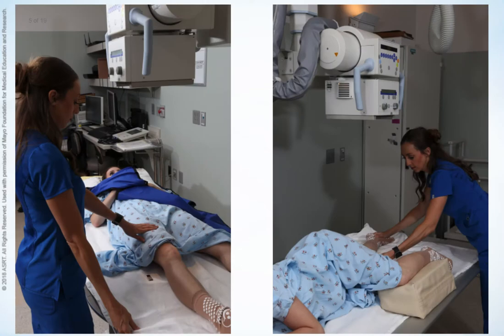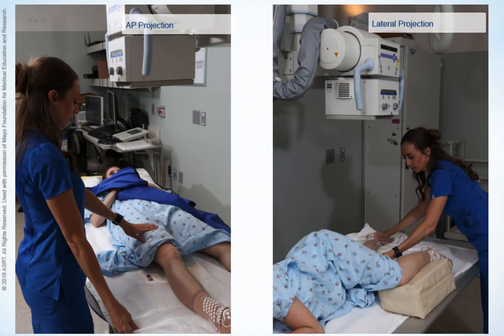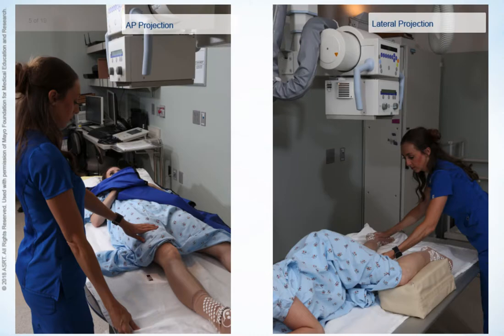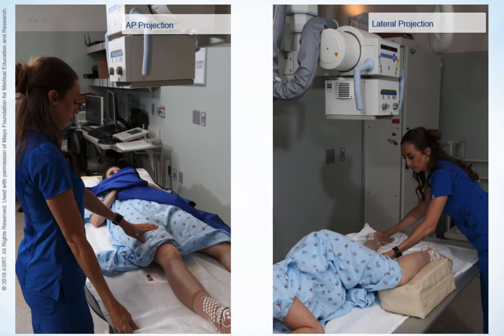The femur is generally examined using two projections: an AP and a lateral projection. When a patient is too tall for the entire femur to be included on a single image, the radiographer performs a projection of the proximal or distal femur to include the joint nearest to the area of interest. Some departments may require a separate projection of the other joint as well. If a patient has an implanted orthopedic device, it must be imaged in its entirety on both projections.